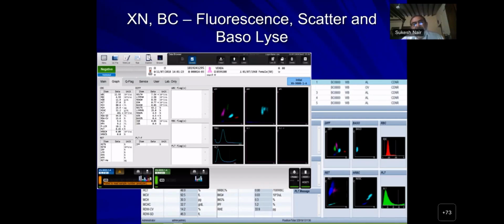I mean the neutrophils. Then you have the green population, and you know that monocytes have got a lot of euchromatin, and they take more of the fluorescent dye, and therefore they show more staining and less scatter.